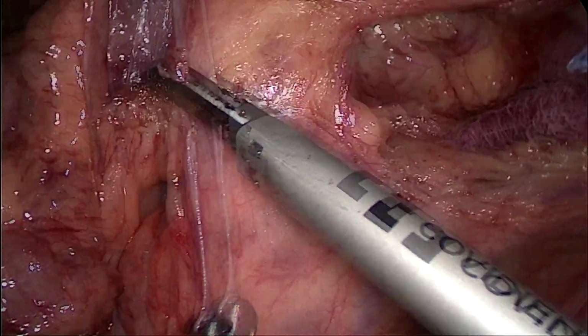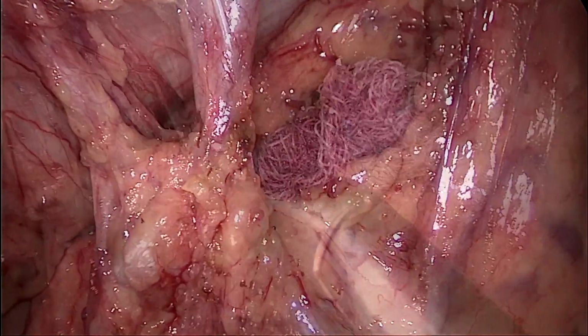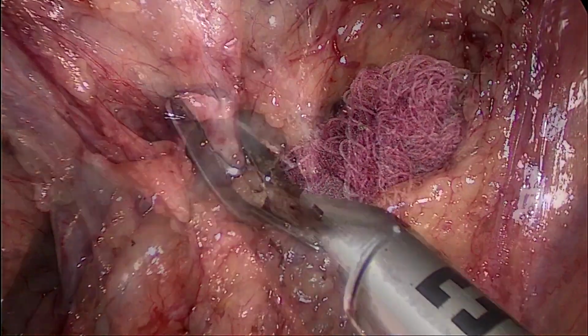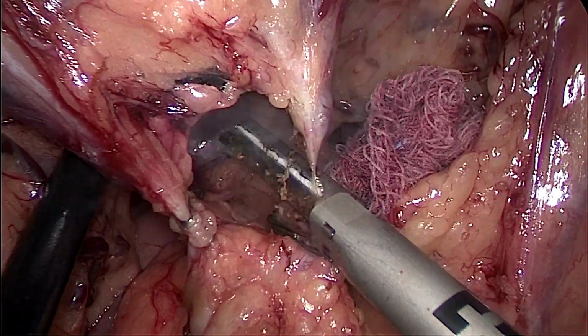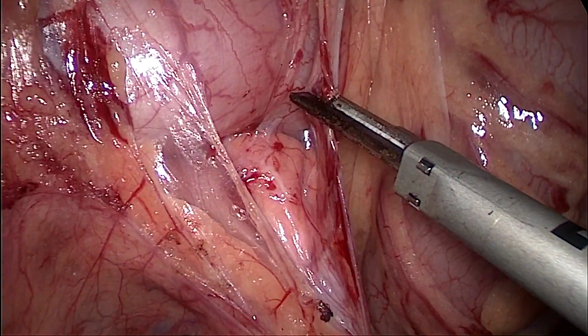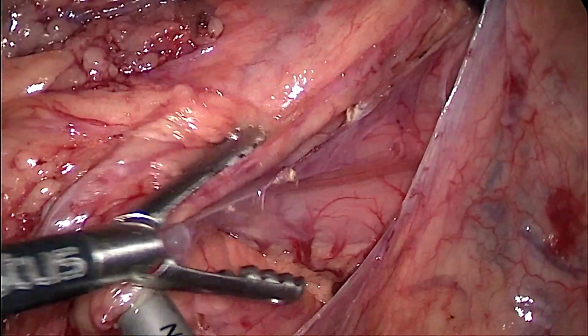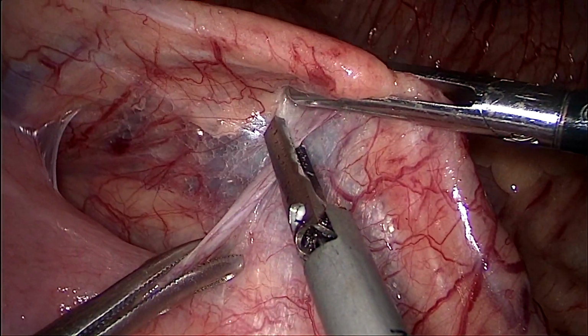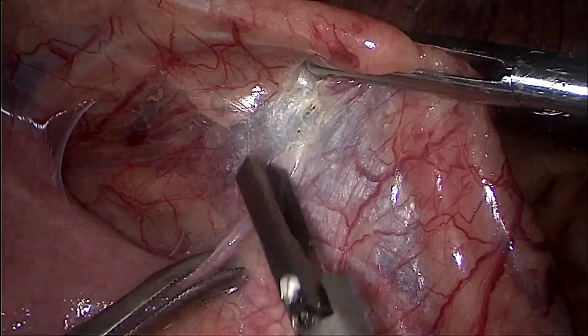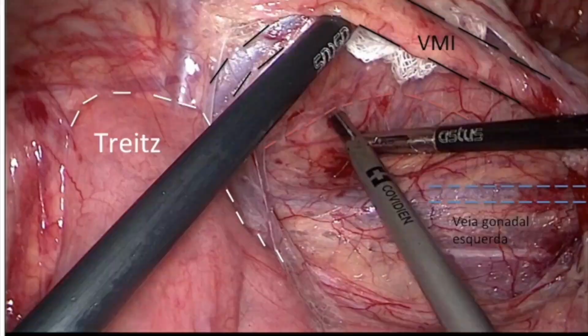Now we're going to the branches of the middle colic vein and artery, so we ligate the left and the right branches. Now we proceed with the dissection of the mesocolon of the transverse colon, and we found the pancreas.